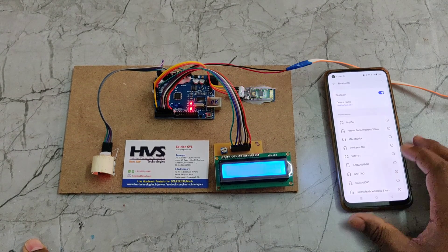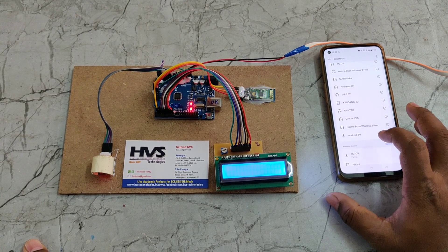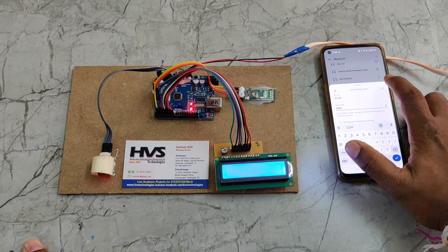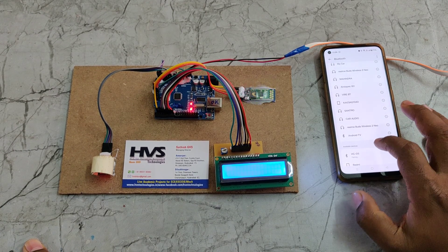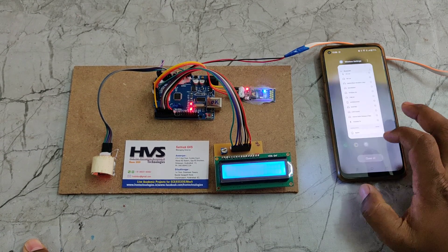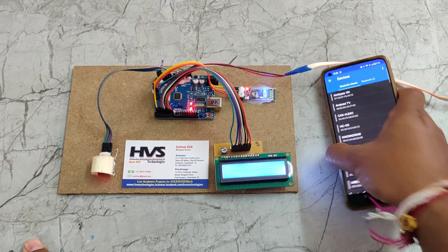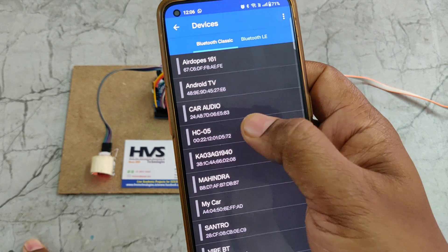For demonstration, any previous pairing is removed first. The very first time, pair the device from Bluetooth settings. The password is 1234. After pairing, it will appear in your history. Then open the application, go to Options, then Devices, and select HC05.